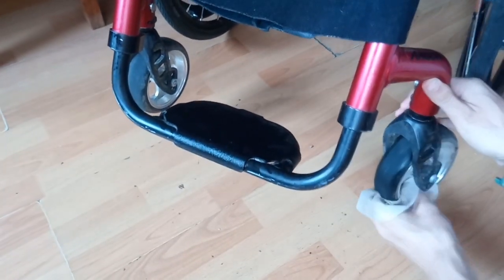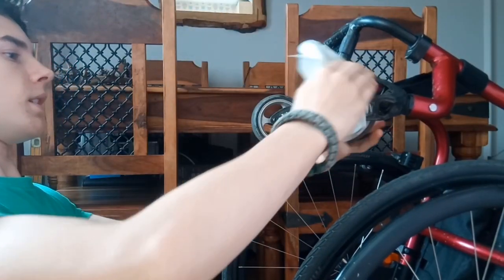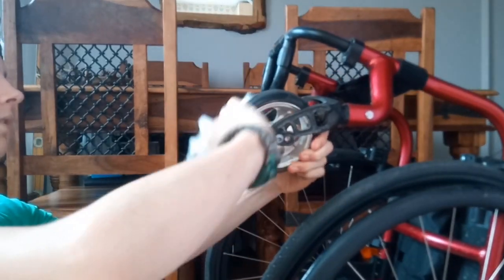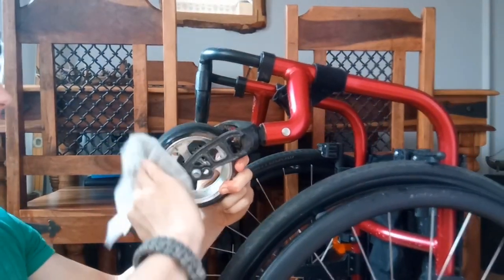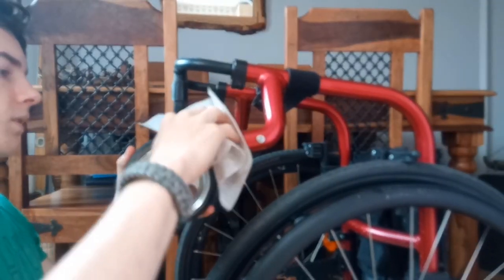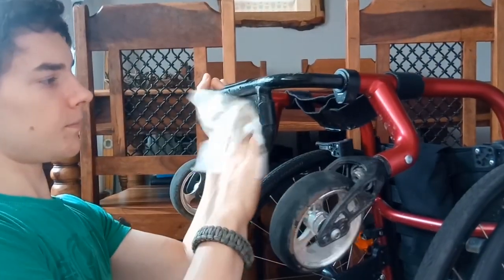Again, just real quick, going back to this, you don't really need to clean this part, but I choose to for stupid reasons. In fact, what I might do is just tip the chair up, and so again, we're basically just doing what we did with the other wheel, with the big wheels. We're just going along the outside and cleaning that off. I will show you how to take this apart as well in just a moment, because in fact I might actually need to do it now. Quickly just clean the underside of this real quick.